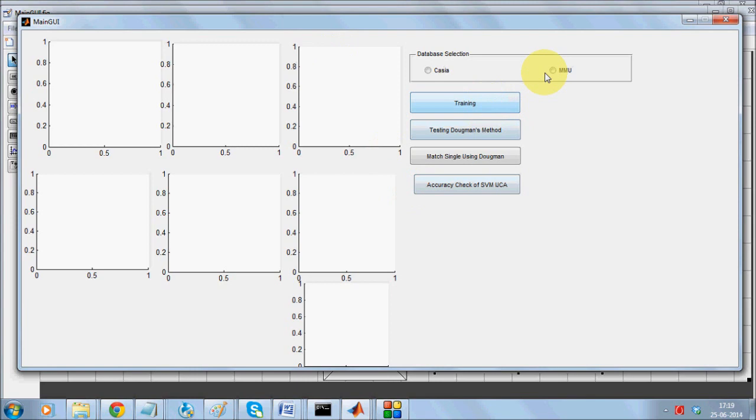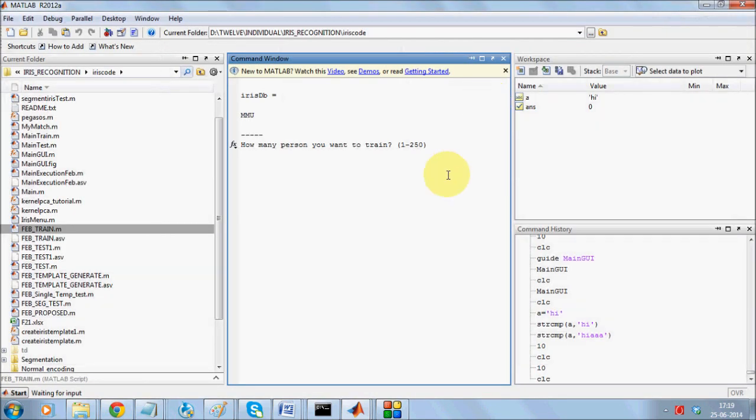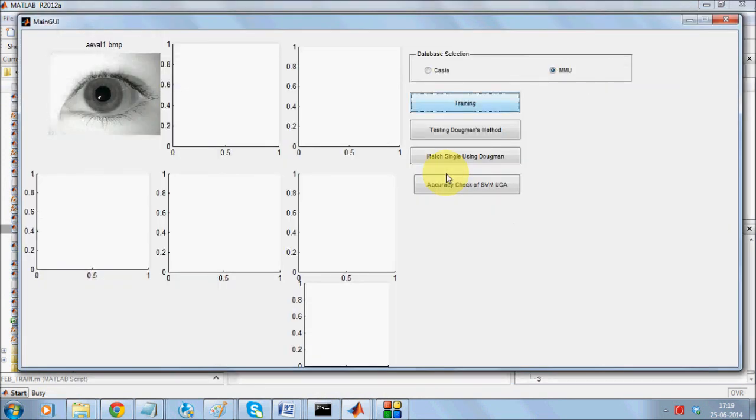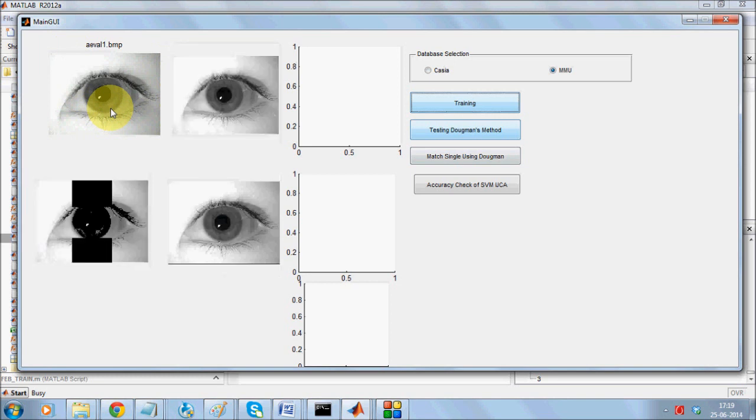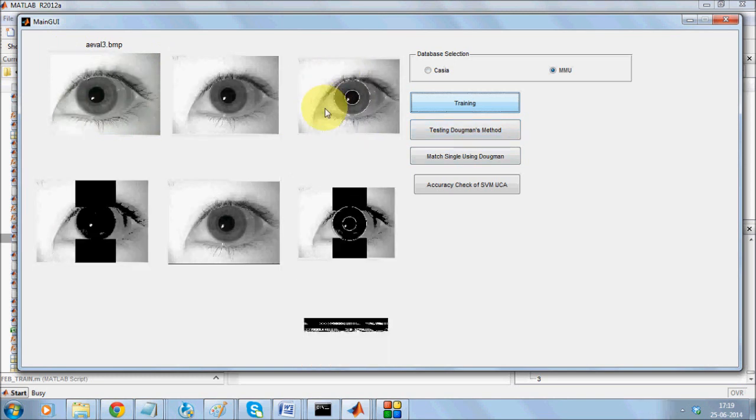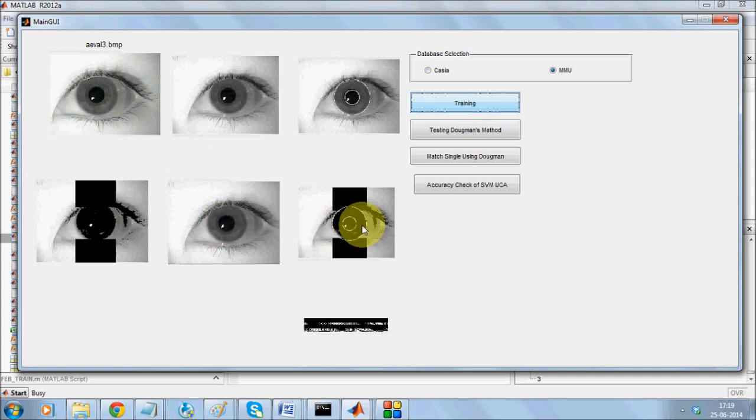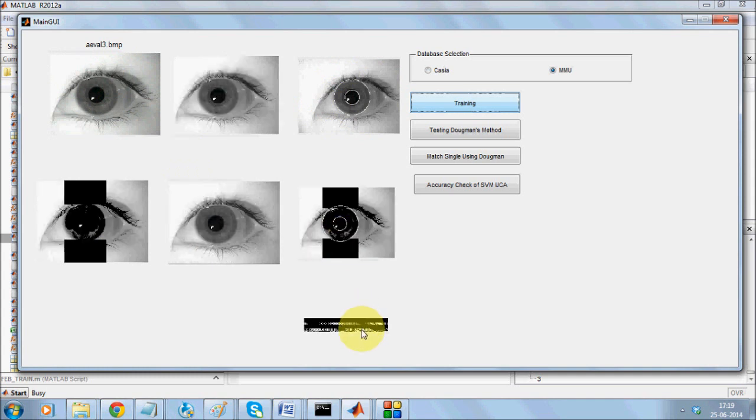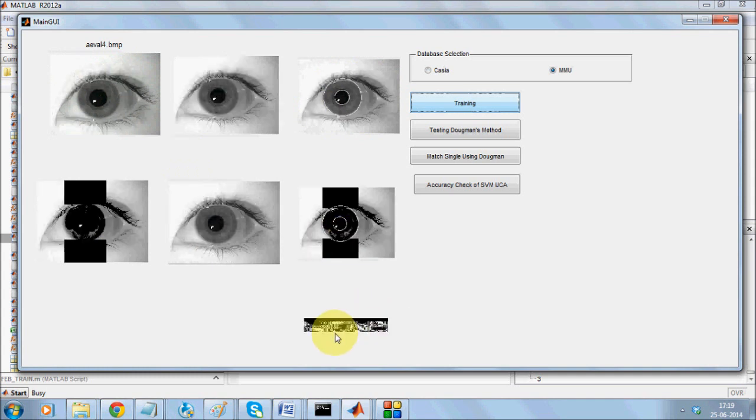So we will straight away go into the work. We will be going for training. Now in order to make it quicker we will be going with training for three instances. It is going to load one image, put a boundary across the image, extract the iris part and then generate a template.